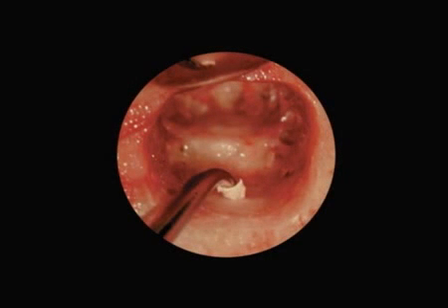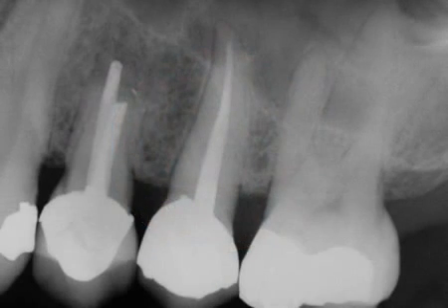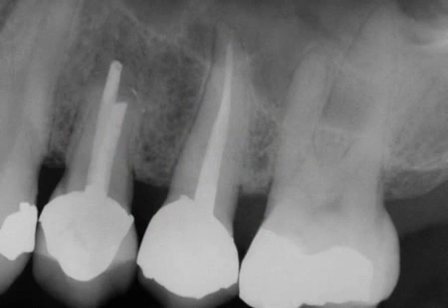Another surgical photograph shows the ultrasonic root-end preparation of the buccal canal. Looking through a Sapphire Plus micromirror, we can see the finished buccal root-end preparation. A 4-year recall demonstrates the apically corked canals and excellent osseous repair.